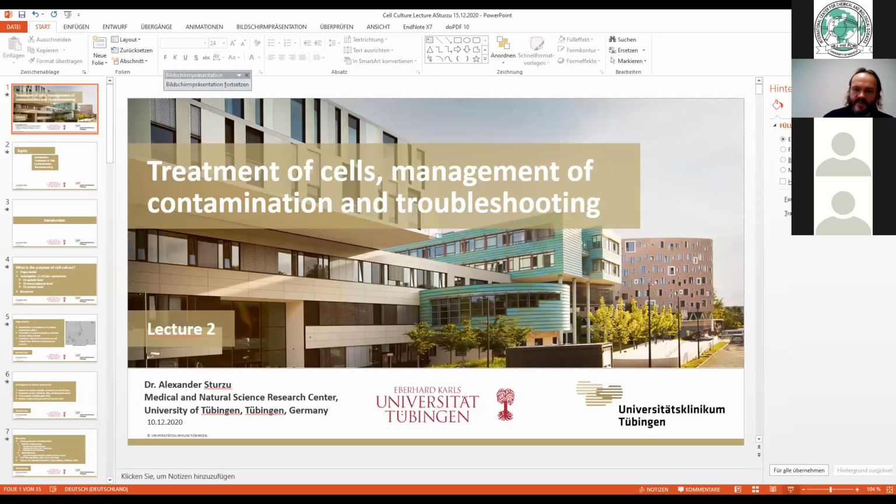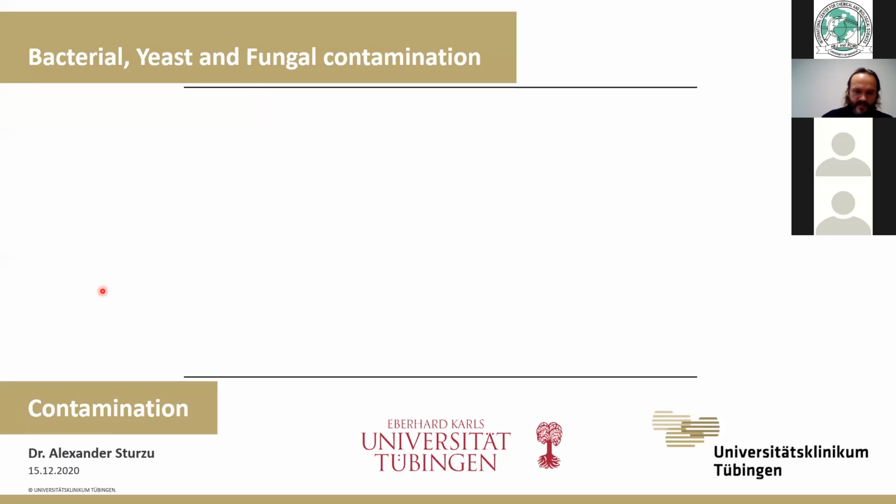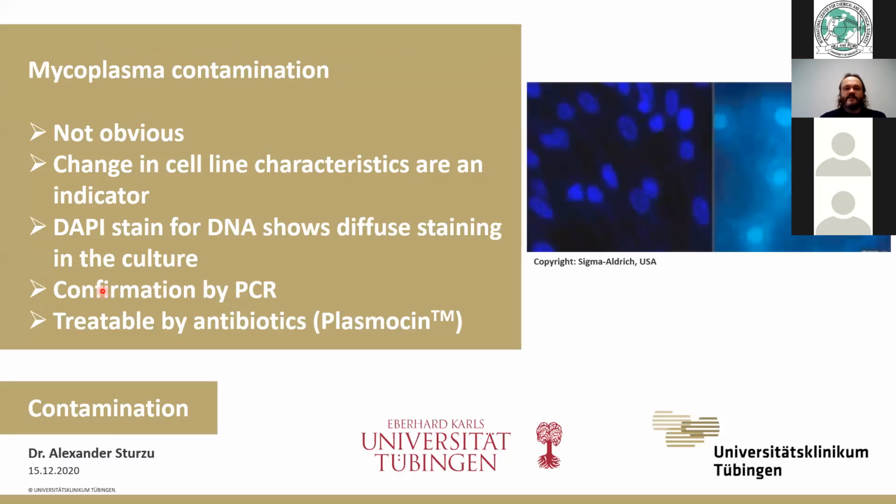Okay, so this was where we were. Next, the mycoplasma contamination. The problem about these mycoplasmas is that they are very small because they're just the very basic components that you need to have a self-replicating cell. And because they are so basic and so small, they can fit through the pores in sterile filters. So even sterile filtration will not save you from mycoplasma contamination.